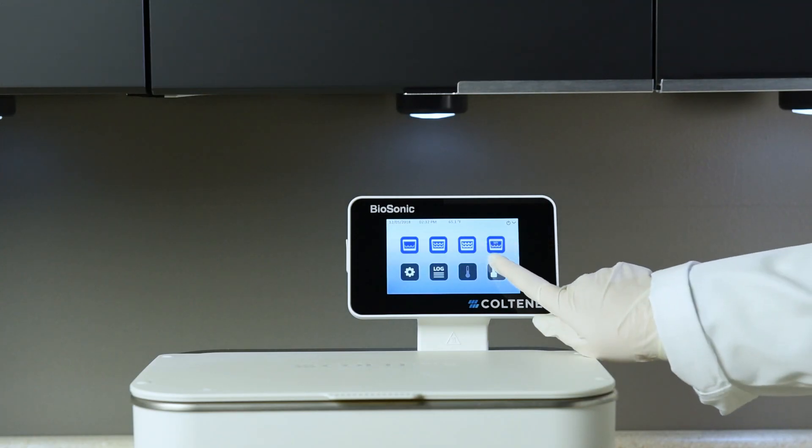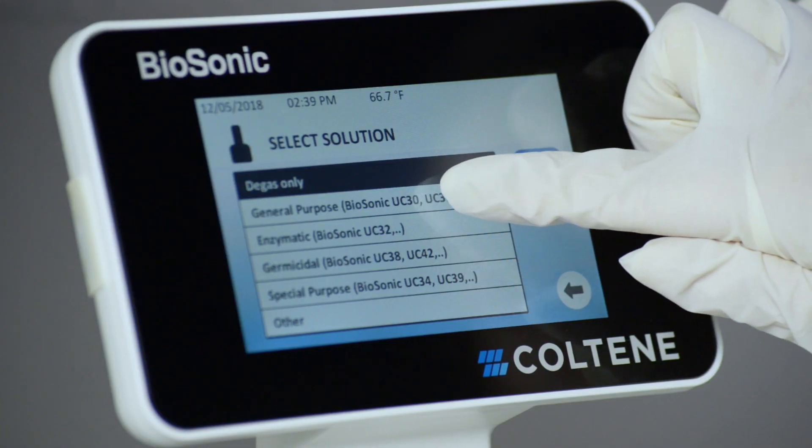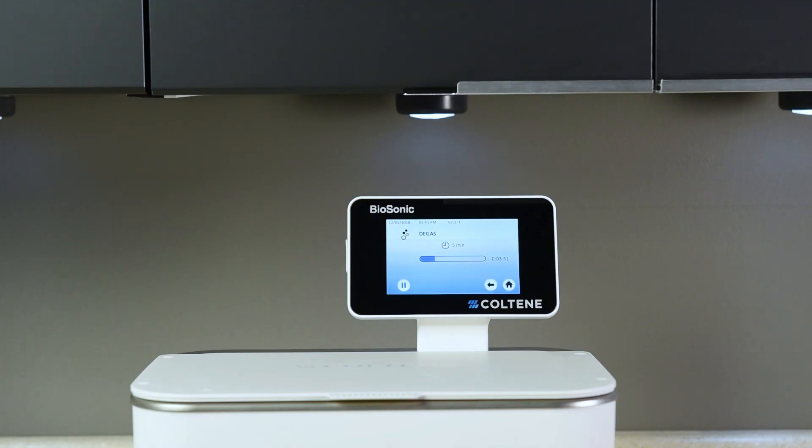Then press the degas icon on the main screen. Select solution type and press the degas icon to start the degassing process. The unit will begin to cycle on and off during the degassing process.